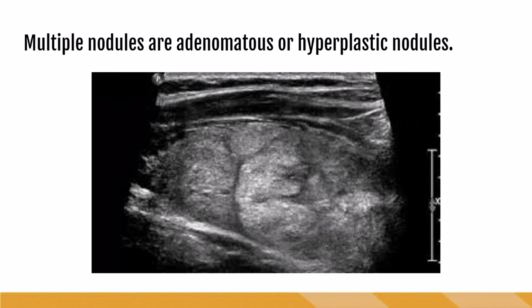We already learned about multiple nodular goiter, and that's due to hyperplastic nodules, which are also called adenomatoid nodules and follow a very similar pathophysiology as the adenoma. The halos may or may not be visible and tend to be multiple nodules in that setting of multiple nodular goiter. So we can see here we've got a long view of the thyroid, and we can see multiple solid nodules just abutting one another. These make for very tricky ultrasounds. Oftentimes we will default to imaging maybe the largest, if they all look the same, to maybe the top 3, depending on the reading provider's preference.